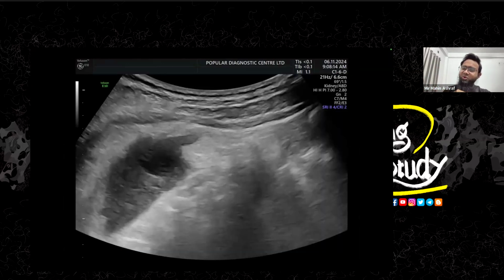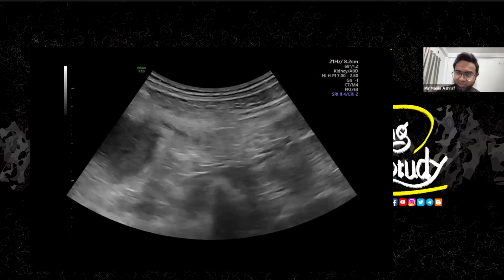Now, let's look at the other parts of this patient. When searching for any other lesion, we found that at the most inferior part of the liver, you can see a hypoechoic, ill-defined, heterogeneous lesion here. And you can see the infrahepatic or subhepatic region shows some thickening of the fat. The surrounding fat plane is thickened. So it took our attention. Let's jump into the real-time view.